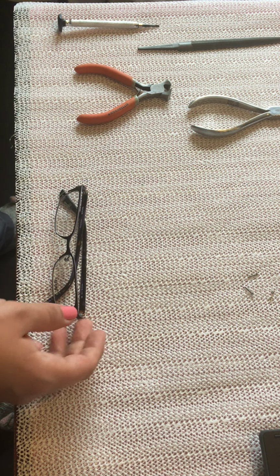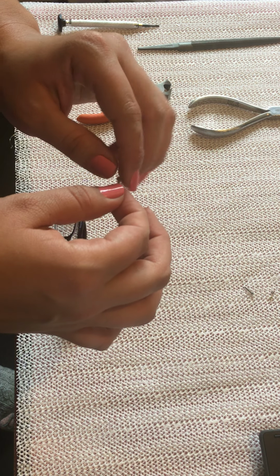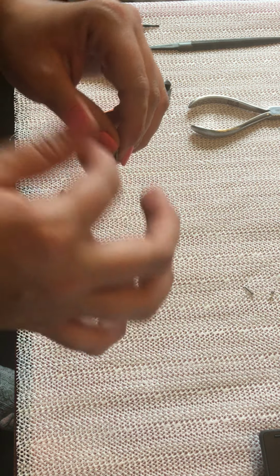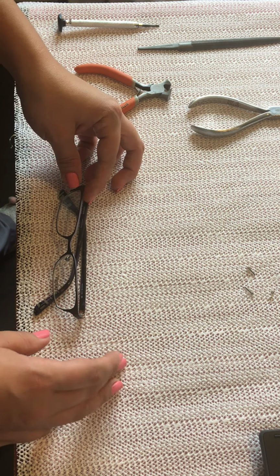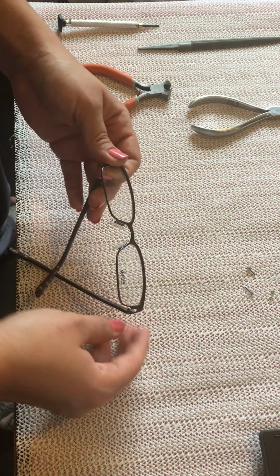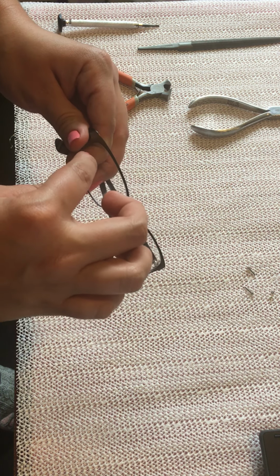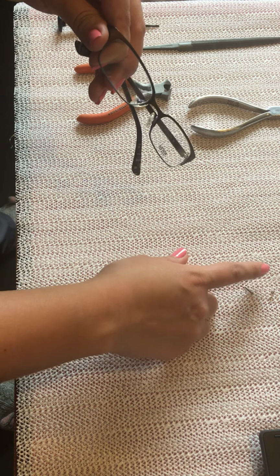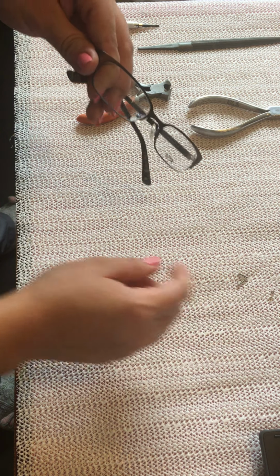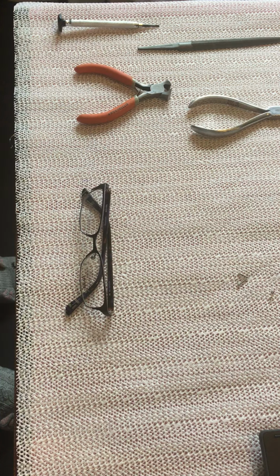We do have something called washers, which are these little plastic thingies that we put in between the nut and the bolt. I don't have them here, but for example, if we were using it on a rimless frame, we would use it in order to protect the frame, to protect the lens. It would be like a little wall in between the actual metal side of the nut and the bolt, in order to protect the actual lens. So that's how we would use a washer.